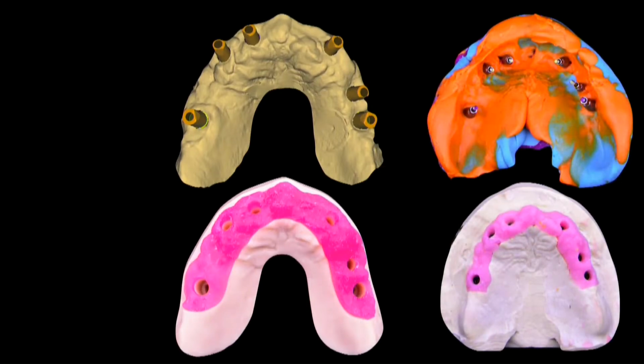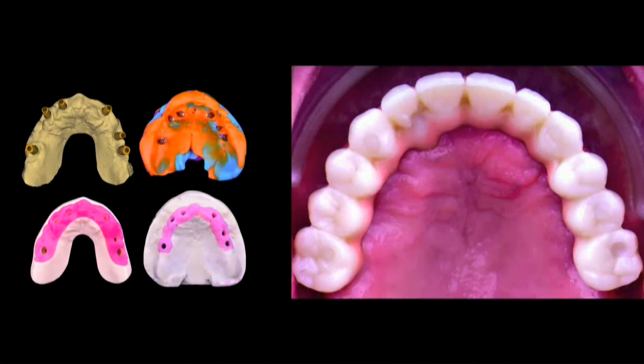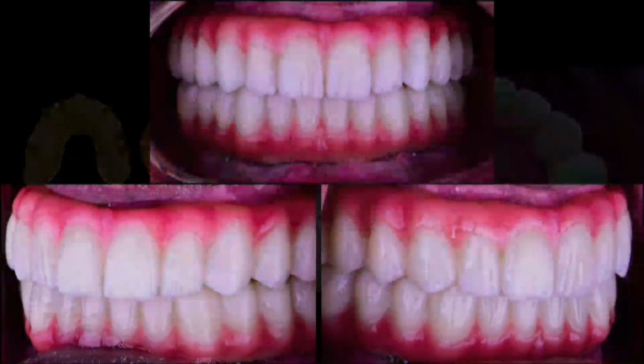Again, supplement your workflow with the analog workflow. I still don't trust this 100%. Go ahead and make the model and fabricate your zirconia. I was lucky enough to have a very well-fitting model. And this is how the patient ended up.